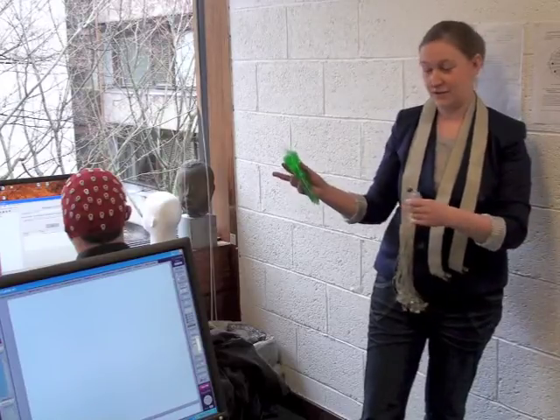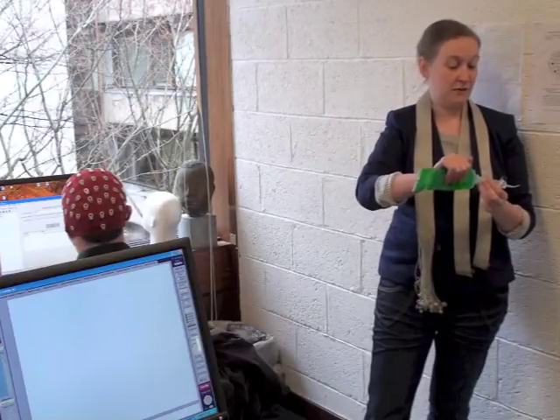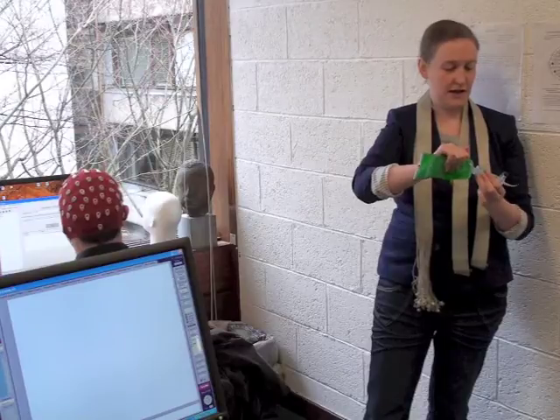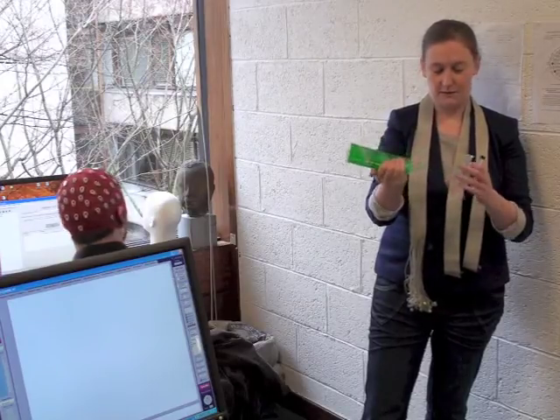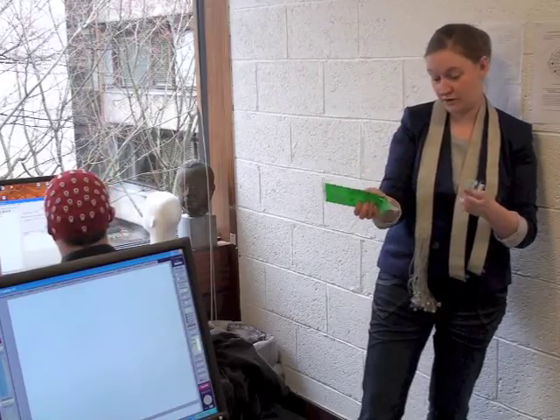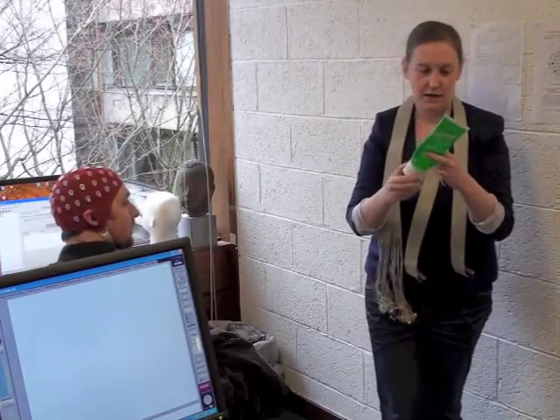These are called active electrodes, so much more powerful than what I'm using, and you just need some gel between the electrode and the head to conduct the electricity. So we have a lot of this gel in the School of Psychology, but you can just order it off the website when it runs out. Am I right in saying it's just kind of like a salt water solution gel thing? Well, you can just use salt water solution if you want, but this is kind of like that, yeah.